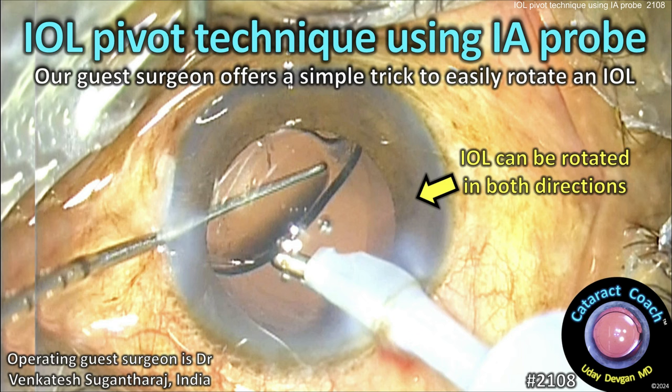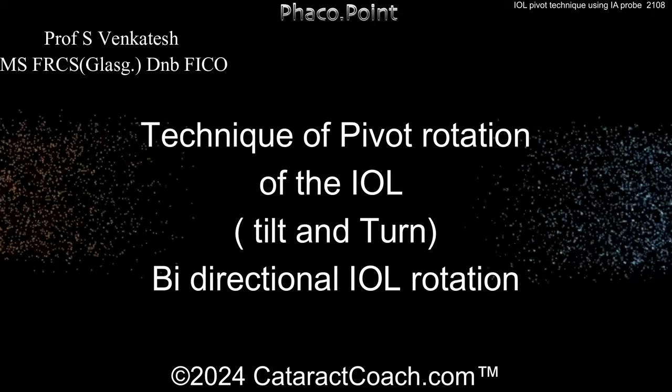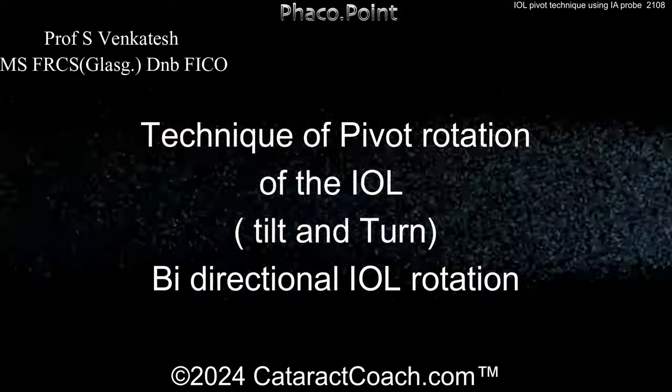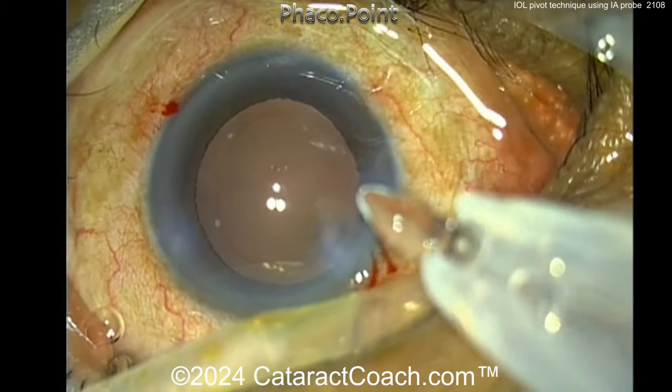Cataractcoach.com presents the eye well pivot technique using the IA probe. A surgeon shares a simple trick to easily rotate an IOL. This technique is called pivot rotation — have you seen this before?